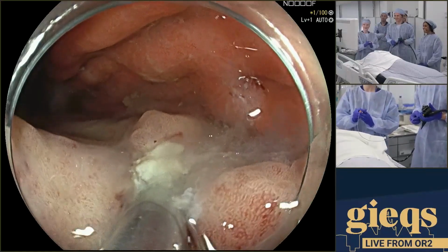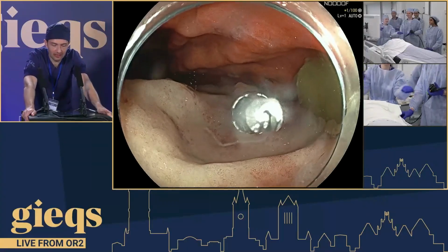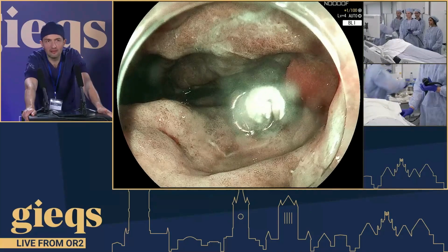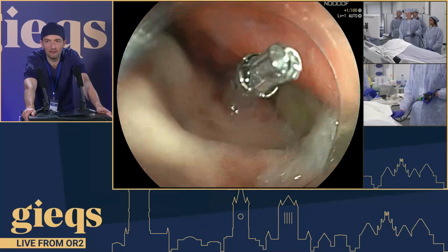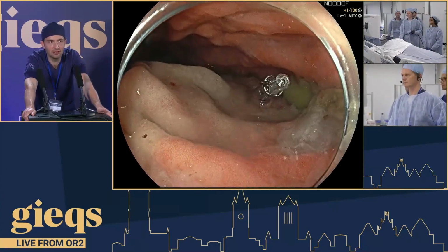And while we're on to that, there's two more questions from the virtual audience while we're watching you, Michael finish this. Question: do you use adrenaline in your lift? Maybe we can give that to Pradeep while you're doing this, Michael. Pradeep, do you use adrenaline in the lift for your resections like this? And if you do, how much?